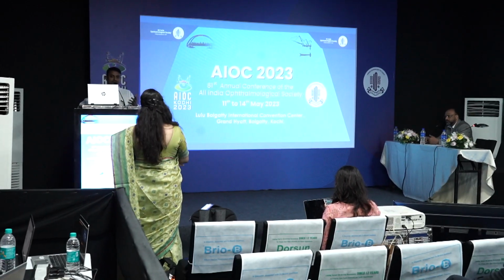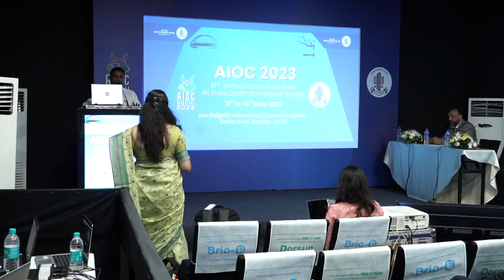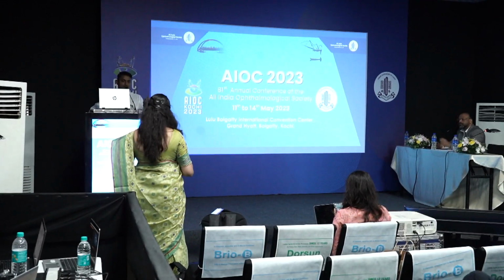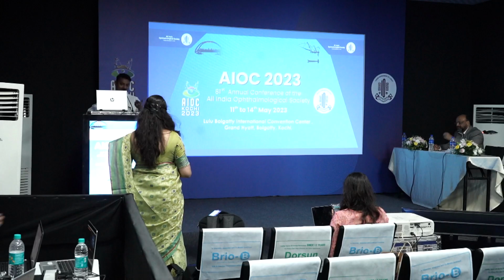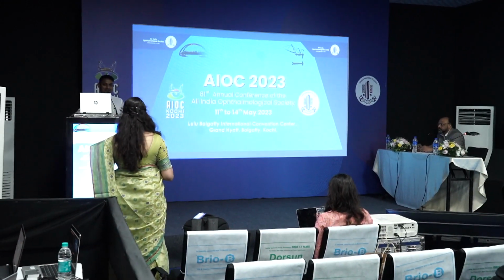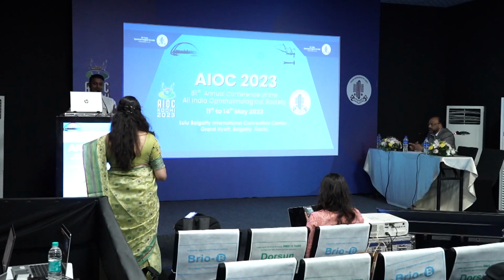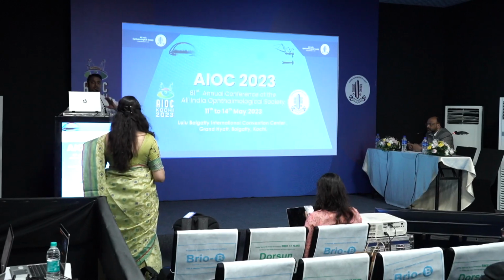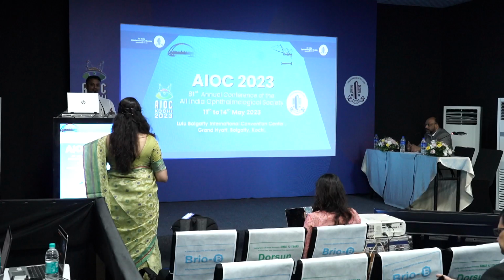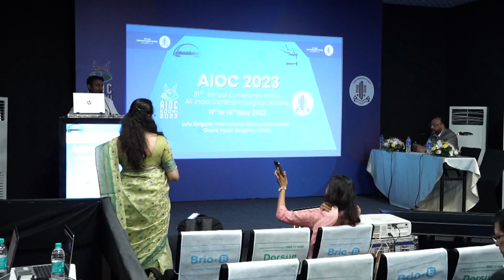Always, in any post-LASIK case, I take three calculations. I do an immersion, I do a Masket, and I also calculate with the ASCRS calculator. I always do these three, because I have not got a single perfect method, even where I follow the Barrett. It is never 100% sure that the post-op result is as predicted. So for the benefit, always take three, decide which is the best, and that's what I practice.